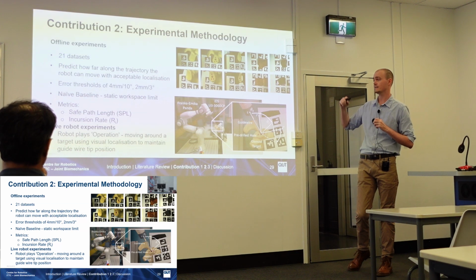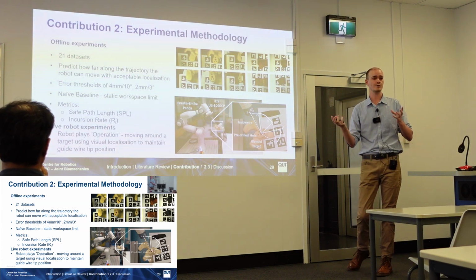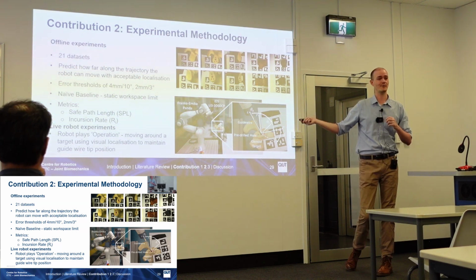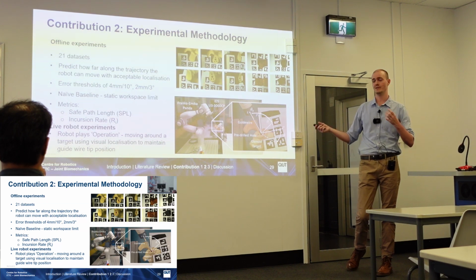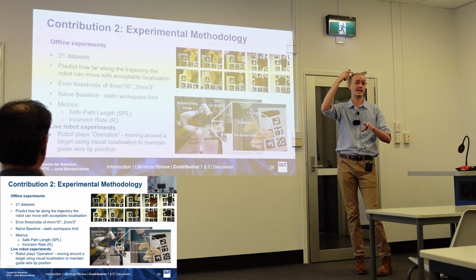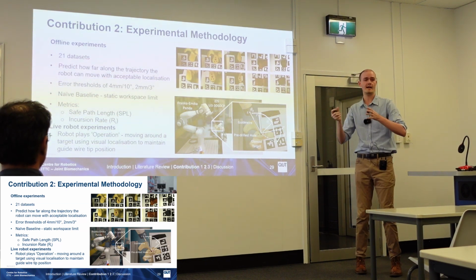We applied our next step predictor approach and predicted where the robot should stop in order to not reach localization failure, but we allowed it to actually continue anyway until it really reached failure, which we defined as the guide wire bumping the model or entirely removing the wire from the hole. And then we compared the two predicted and actual failure points.